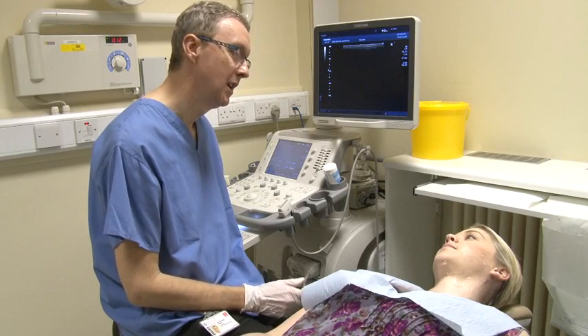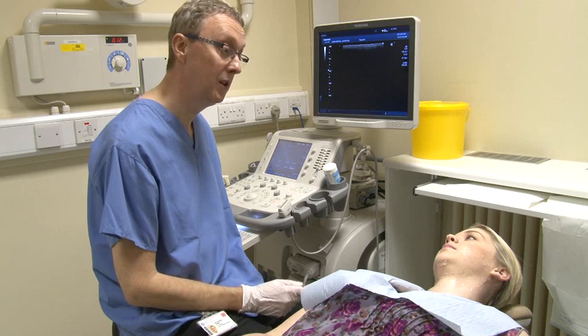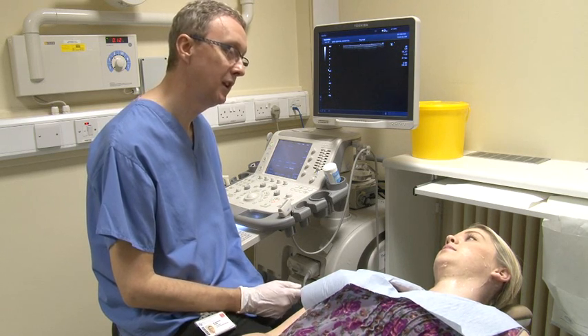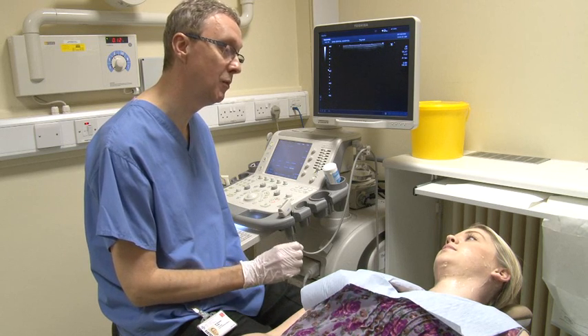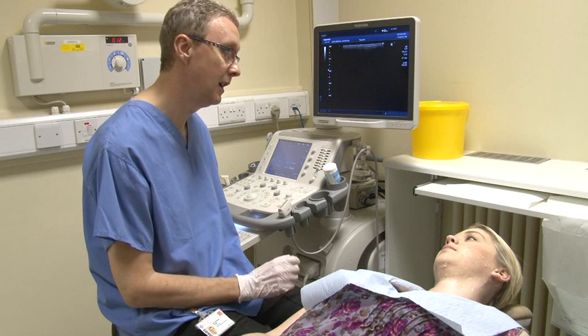Sometimes, if you have a neck swelling for example, it may be necessary for a sample to be taken. This helps the doctor looking after you to provide you with the appropriate treatment. Ultrasound guided biopsy is a commonly performed procedure. The radiologist will explain to you what the procedure involves.